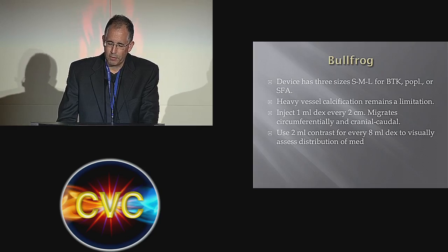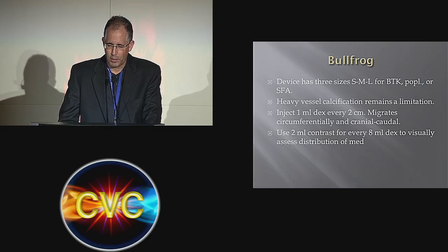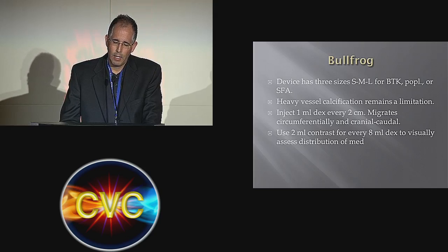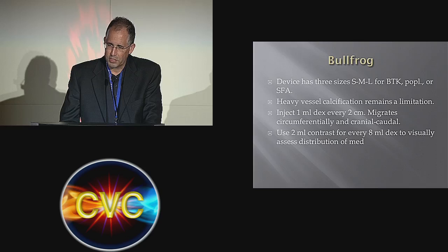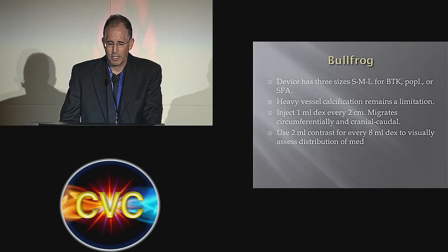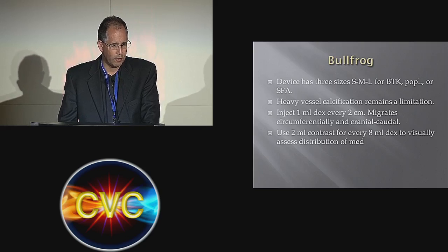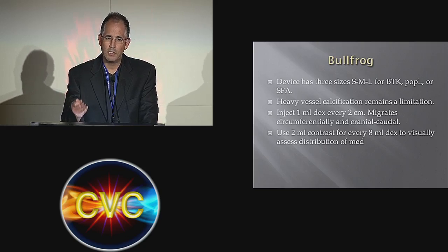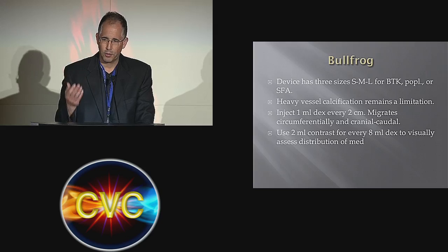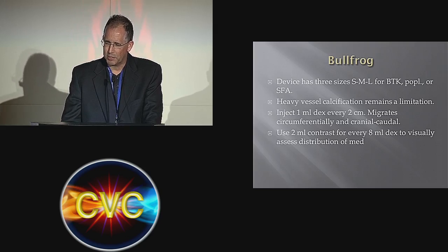So if we're using drug-eluting balloons or drug-coated balloons, the restenotic process is actually pretty easy to retreat. You can go in, it crosses easily, it's soft, it's easy to re-atherectomize. If we do a drug-coated stent, when those restenose, I find it a little bit arduous, a little bit laborious to get through an occluded stent. The proximal cap is usually really, really hard. Miguel Montero Baker did a case this morning where they couldn't get through the proximal cap, so what he had to do is stick a needle into the stent in the mid-SFA and go through retrograde. And it's doable. I've done it. A lot of us have. But it's arduous, right? It's time-consuming. It's lengthy.